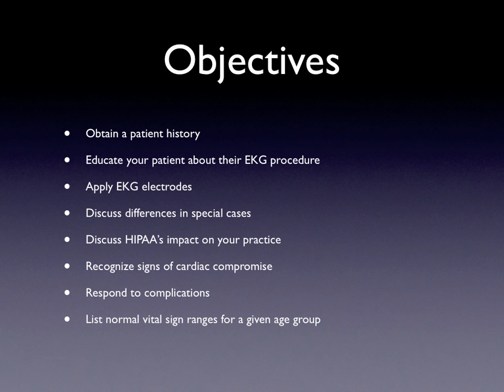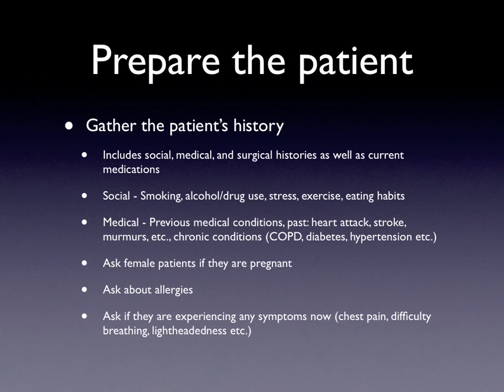So the first thing we need to do is we need to prepare the patient. In this, we need to gather the patient's history. Now, in real life, in practical applications, this is not usually something that the EKG technician needs to do, but it's something you might need to do if you were working, say, in a cardiologist's office.